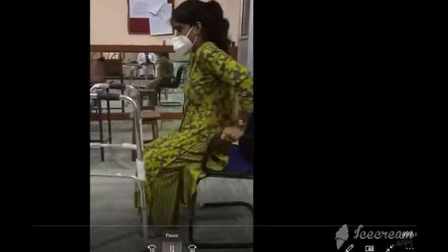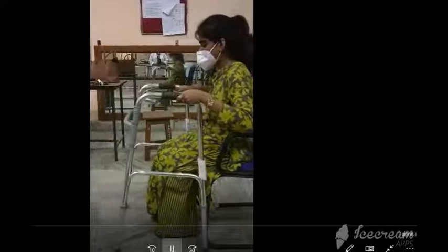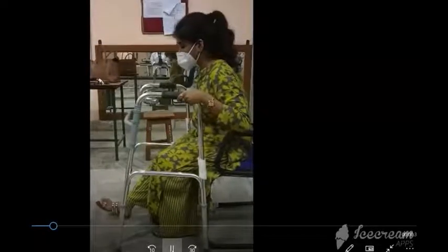To get up from the chair, extend the affected extremity first, then hold on to both armrests of your chair as you slide forward.